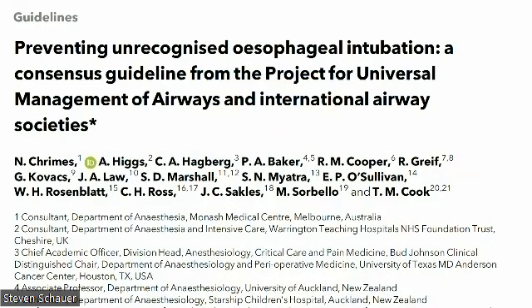So I'm going to review the new Difficult Airway Society guidelines on the exclusion of potential esophageal intubation when that is on the differential for the crashing patient. Previously, other guidelines alluded to this problem, but this is the first time they have released focused guidelines on this specific issue. Previous guidelines had themes of when in doubt, take it out, and no trace, wrong place. The theme with this particular guideline seems to be sustained exhaled CO2.